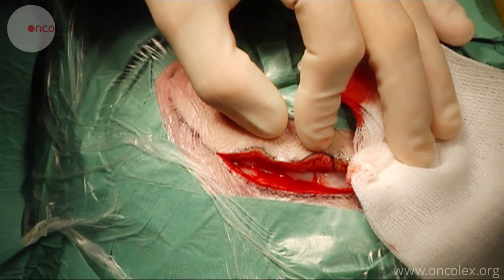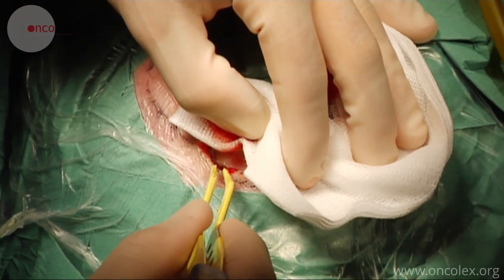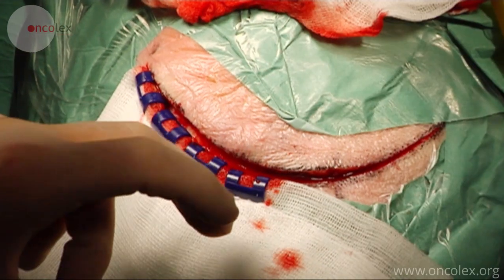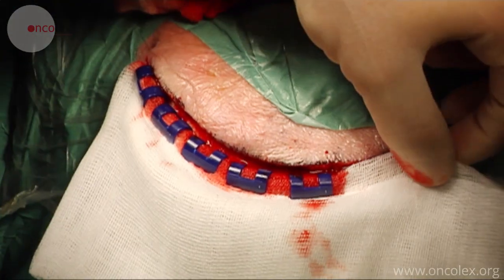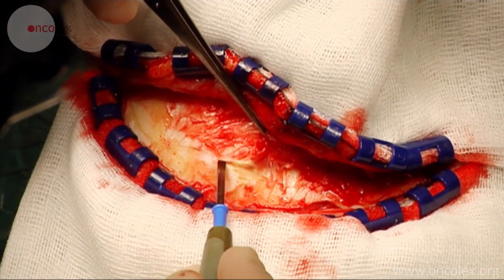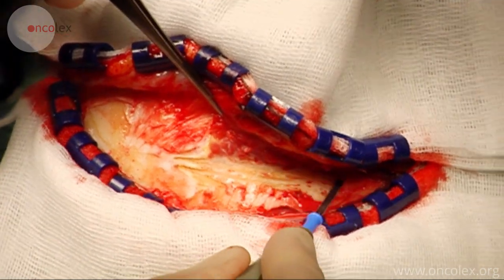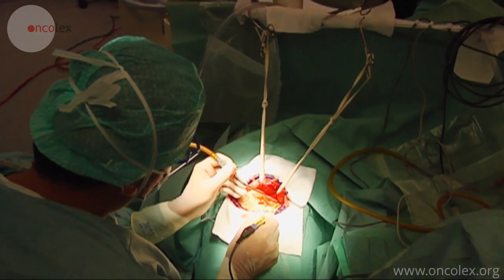The operation starts by making an arced incision in the skin. Sponges are attached along both wound edges to achieve hemostasis in the scalp. The skin flaps are dissected from the cranium and kept away from it with rubber bands.